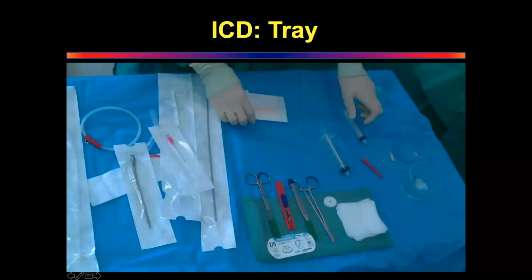Okay. What is this? This is the guide wire with the sheath of the guide wire. Tell me two types of guide wires that are available. The firm and the soft ones. Very good. Excellent. Well done. What is this? This is the Seldinger's needle, or the puncture needle. Very good. What is this? Dilator. Excellent.